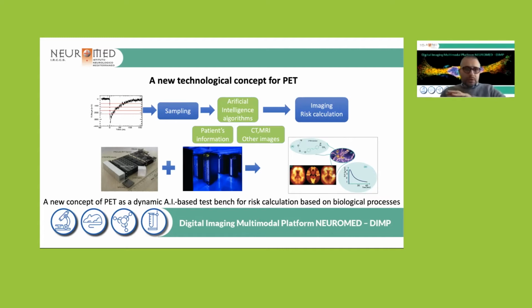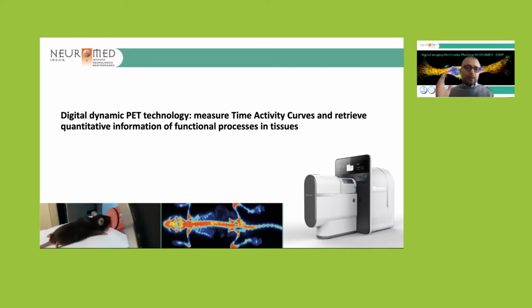So this was an introduction in order to put the students and people not really familiar with PET in a position to follow what comes next. And if I were to conclude this introduction with a clear sentence, I would say: digital dynamic PET technology measures time activity curves and retrieves quantitative information of functional processes in tissues.